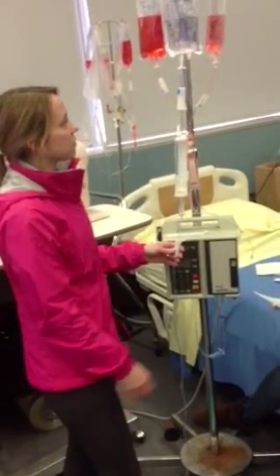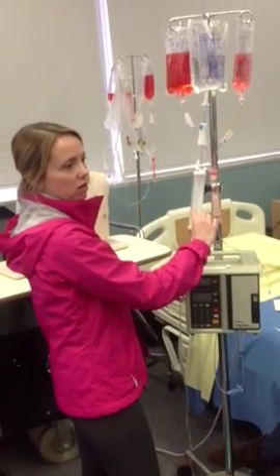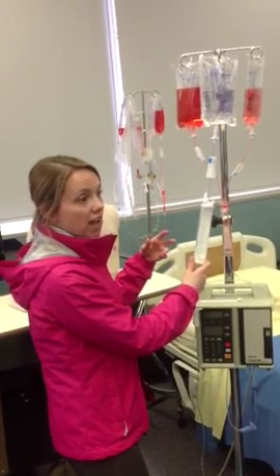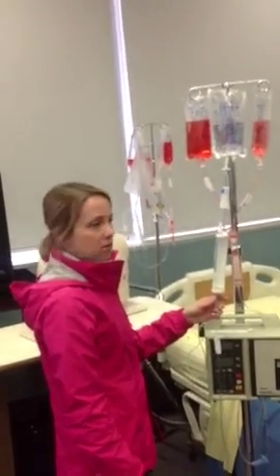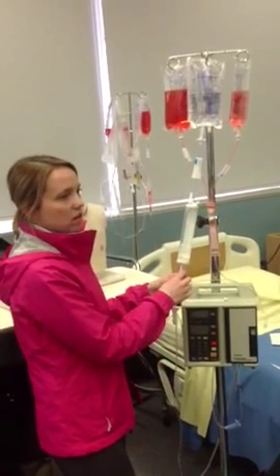You only use the top clamp when you want to refill the chamber. This chamber is just a buffer, basically, so that if the fluid starts running too fast, the patient can never get too much. So the top one is always closed — you're really never giving fluid from the top at all, just from the middle chamber.